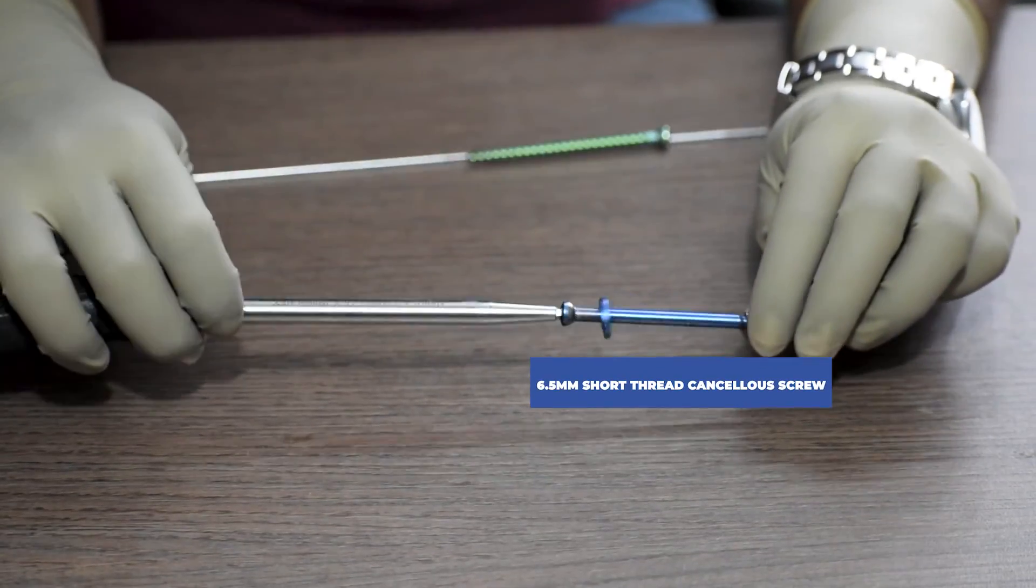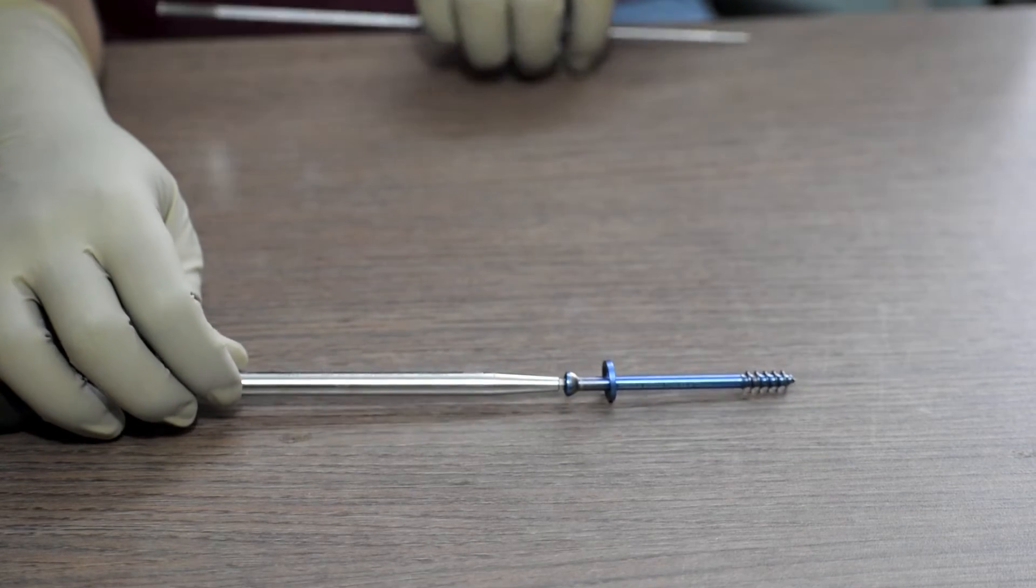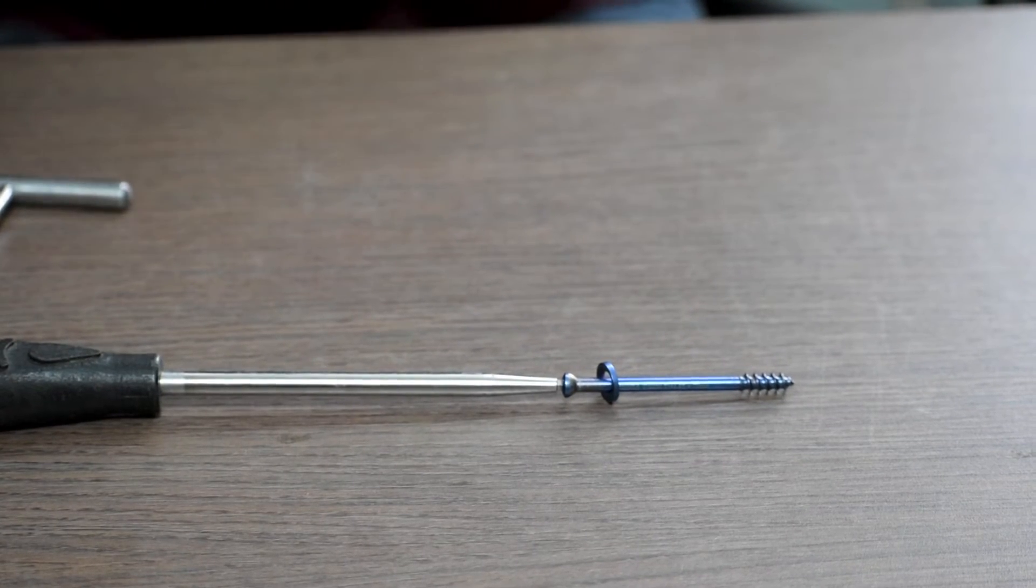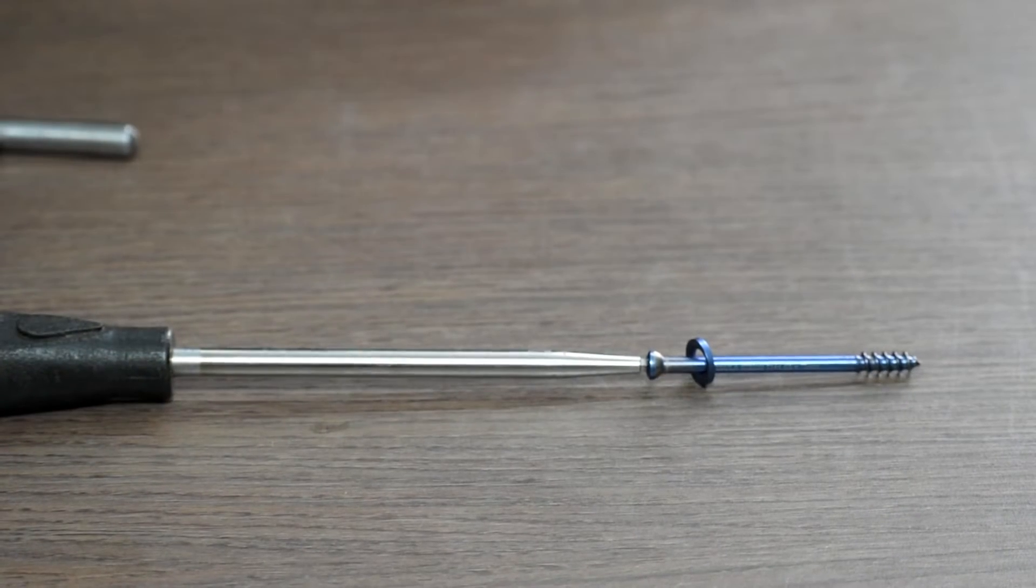And then, with the help of a 4.5mm solid screwdriver, we will fix the screw in the desired location. The solid screwdriver is used to do the final tightening.